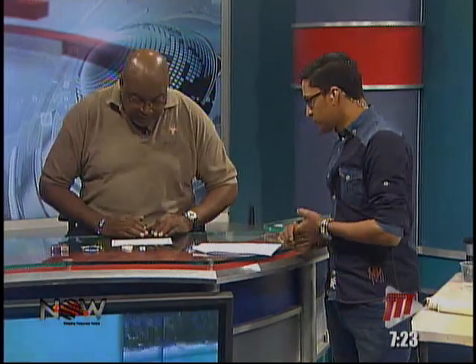Mr. Lesford Moses, HIV Rapid Test, Barataria Wellness Centre. He is still with me. We did the test just before the news, and we have the results. It's good news for Rishi. Yes, it's negative, which is good. But we had put blood on 2 instruments. This one is what? This is the determine stick.